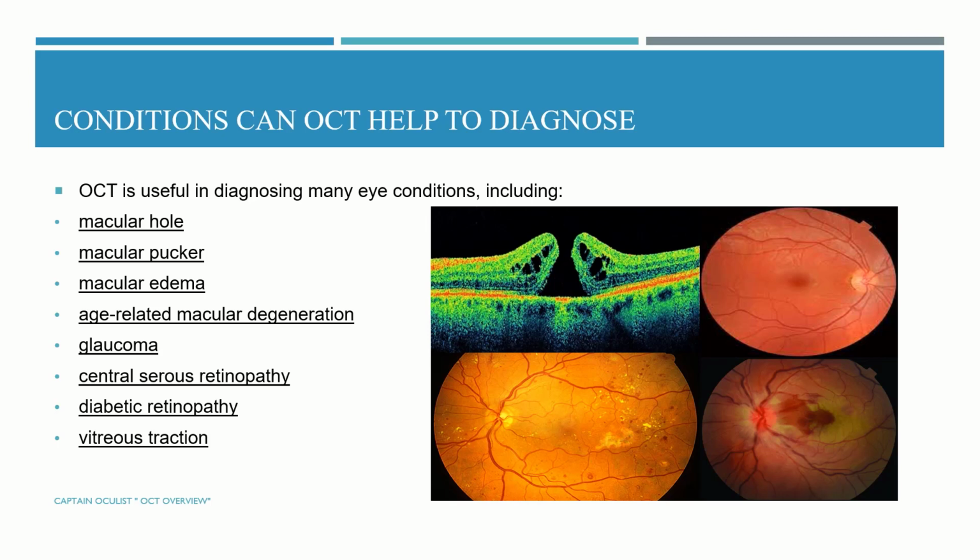Conditions where we do use OCT, or where a doctor refers a patient to get their OCT done by an optometrist, are macular hole, macular pucker, macular edema, age-related macular degeneration, glaucoma, CSR, diabetic retinopathy, and retinal detachments.